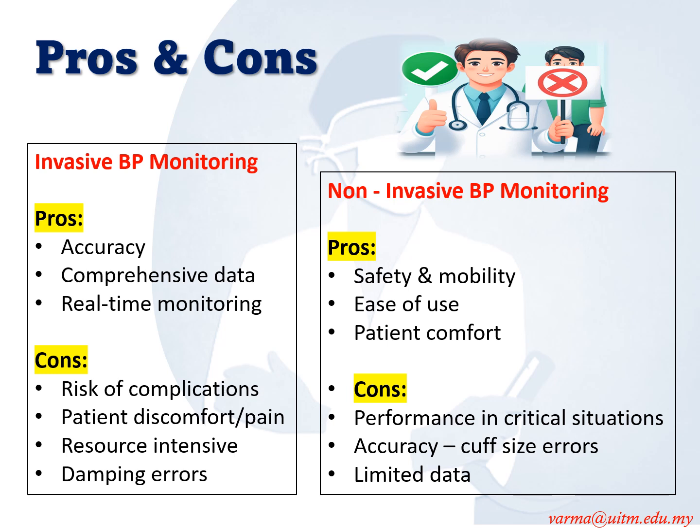Invasive blood pressure monitoring has many complications compared to non-invasive. The first is injury to the arterial wall causing bleeding, hematoma, and infection, and it can also cause arterial vessel stenosis and lead to ischemia of the distal extremities in the patient. Patient discomfort and pain is another factor that must be looked into when planning for invasive blood pressure monitoring. Thus, adequate LA or sedation has to be given to make sure the patient is not restless.